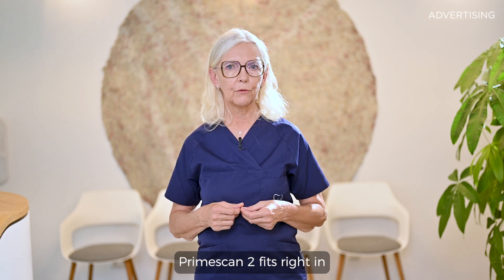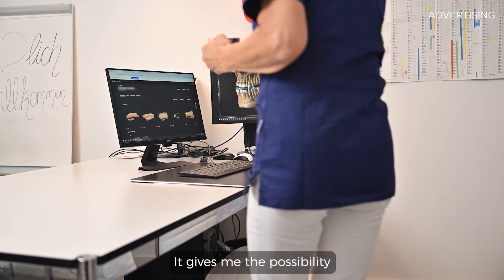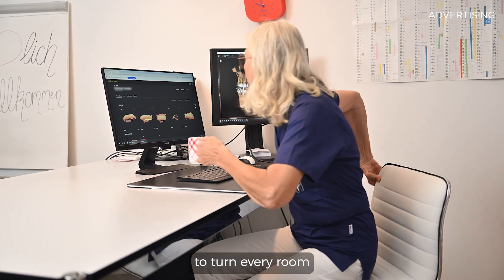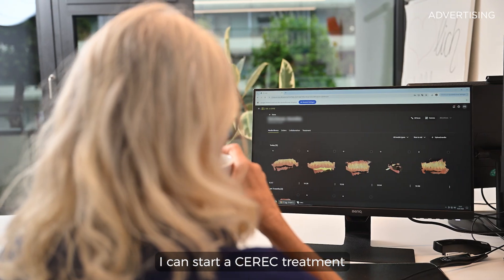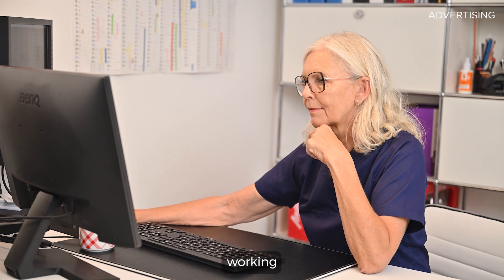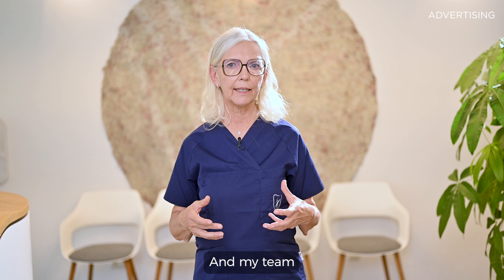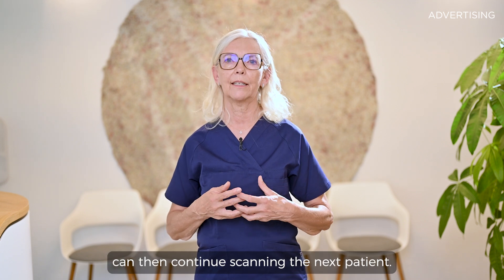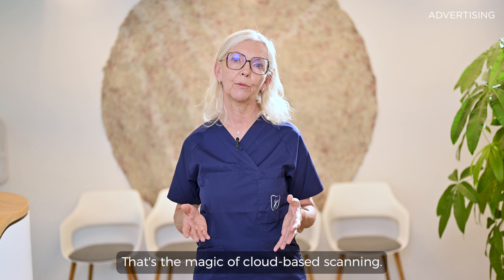PrimeScan2 fits right in with the classic chair-side CEREC workflow. It gives me the possibility to turn every room in my practice into a CEREC room. I can start a CEREC treatment from every room and continue working on the design independently of the scanner itself, and my team can then continue scanning the next patient. That's the magic of cloud-based scanning.